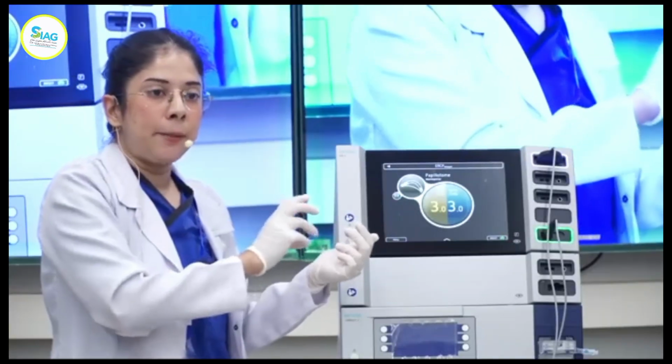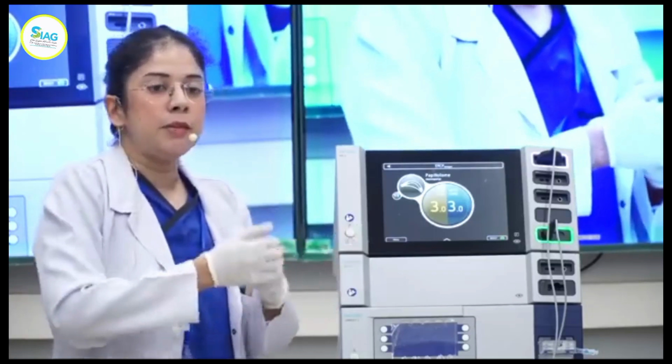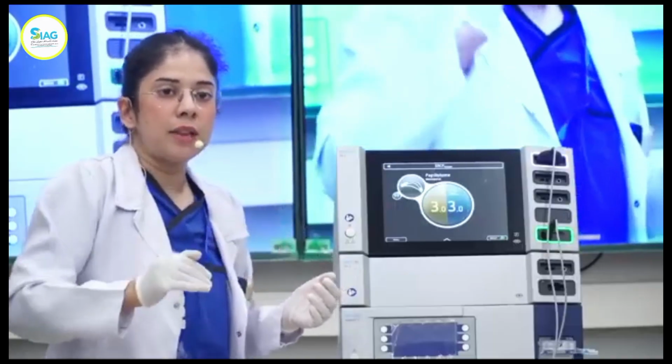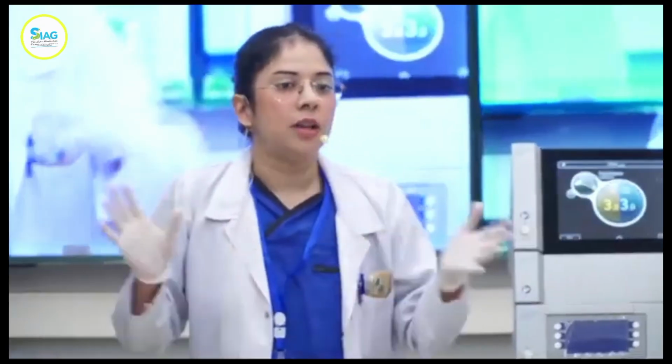Endocut can be used, for example, in sphincterotomy. It can be used for polypectomy. It can even be used in POEM when you're first making the mucosal cut. When you're dealing with denser tissue that you need to cut through, you can use any type of current as long as you understand what kind of energy it'll provide to you. So everything about this lecture is, if you have a continuous flow of current, all is well and good.